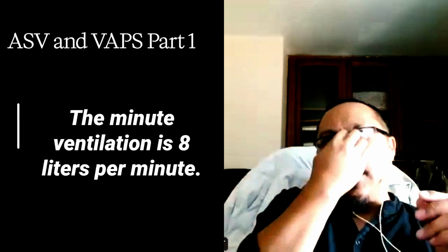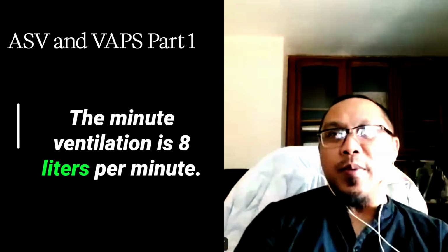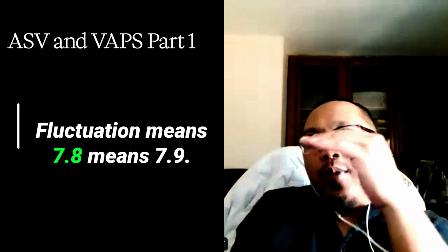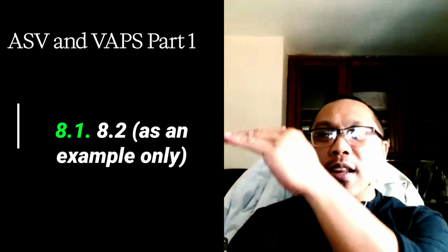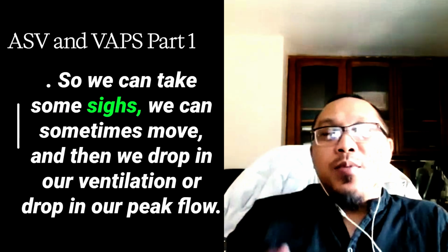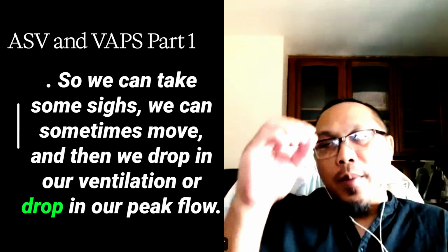The minute ventilation, let's say, is 8 liters per minute. There is some fluctuation, sometimes 7.8, sometimes 7.9, sometimes even higher. So we can sometimes move and then drop in our ventilation or drop in our flow.